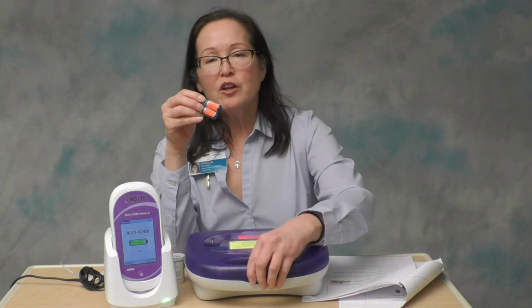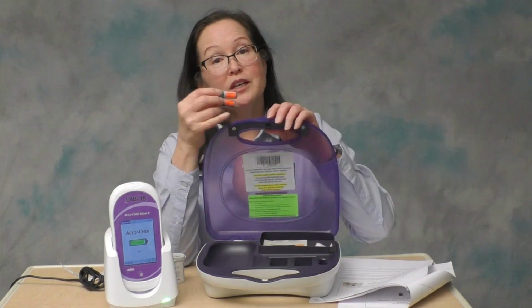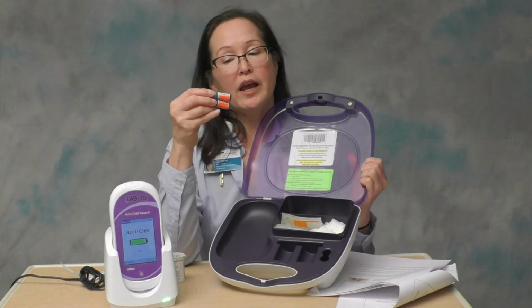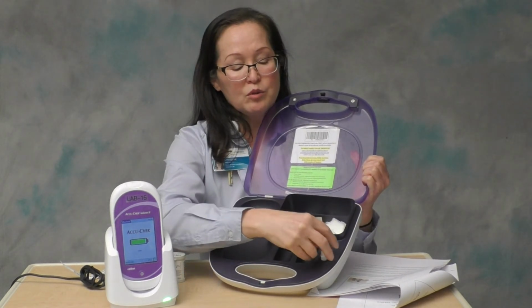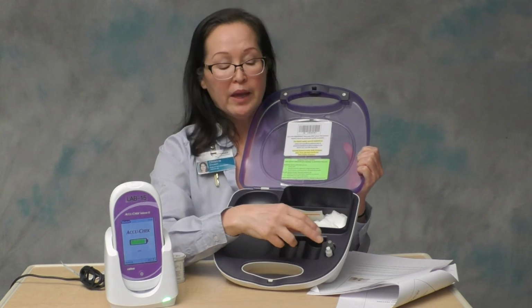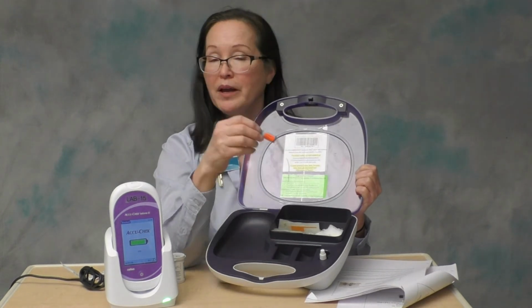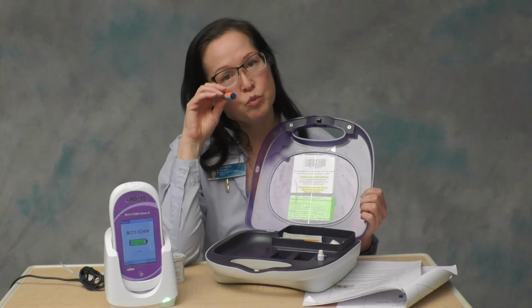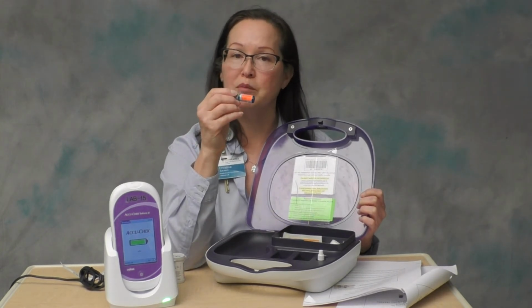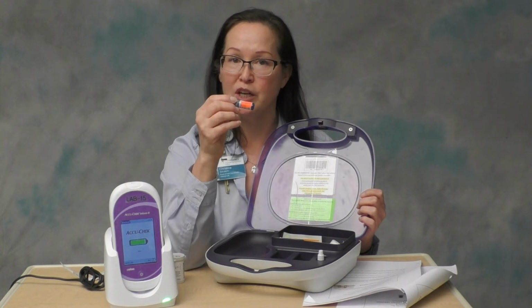Because these bottles are little, it's easy to lose them. Sometimes they get thrown in the garbage by accident. I always recommend after you run the QC that you store them in the tote, put them right back in the tote where they belong. If they get thrown out by accident, call our office. You have to call our office to get new controls so we can make sure they have the correct expiration date on them.